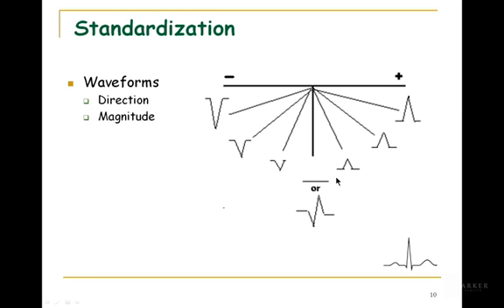isoelectric or baseline. Or you might have what we call a biphasic or equiphasic recording, in that if I measured the voltage here and here and added them together, they'd add up to 0. So one of the things that determines the magnitude of the waveform would be how the current is flowing relative to the lead that you're recording. Whether it's upwards deflected or downwards deflected is determined by whether it's running towards the positive recording electrode or the negative recording electrode.